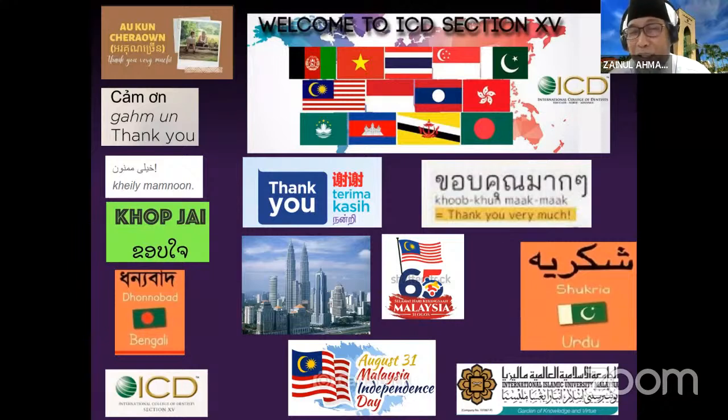Sometimes you can see a cranial implant made without 3D reconstruction that is not symmetrical, because they are all in 2D. They don't have XYZ coordinates for recontouring the contour of the skull cap, for example, because there is some concavity. So by PSI we mean a patient-specific implant dedicated to that particular patient, with the right size, right height, right breadth and right contour, so it is aesthetically acceptable.